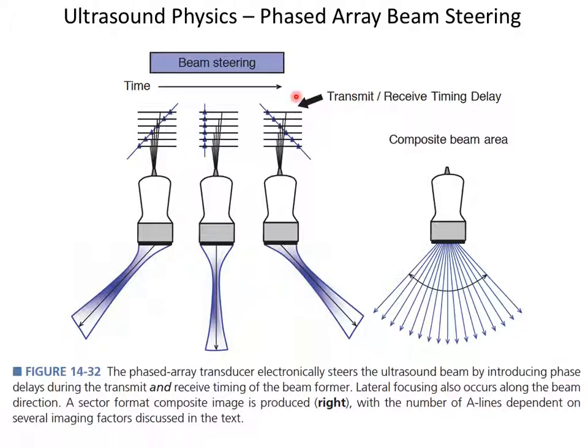And so this is how you do the sweeping. Okay. So we have a phased array of these crystals, and we used the phased array in this condition when we were looking at it the first time to focus the ultrasound energy such that it was at a narrow point or a focal point optically, right?